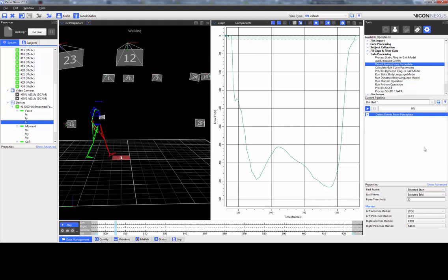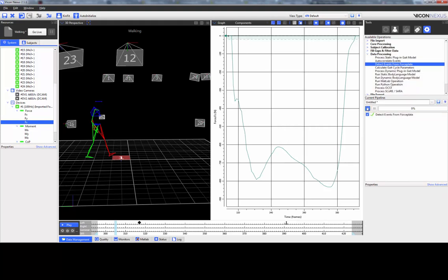Now when I run the pipeline operation, we can see that the foot strike and foot off events for the left foot have been put into place automatically.